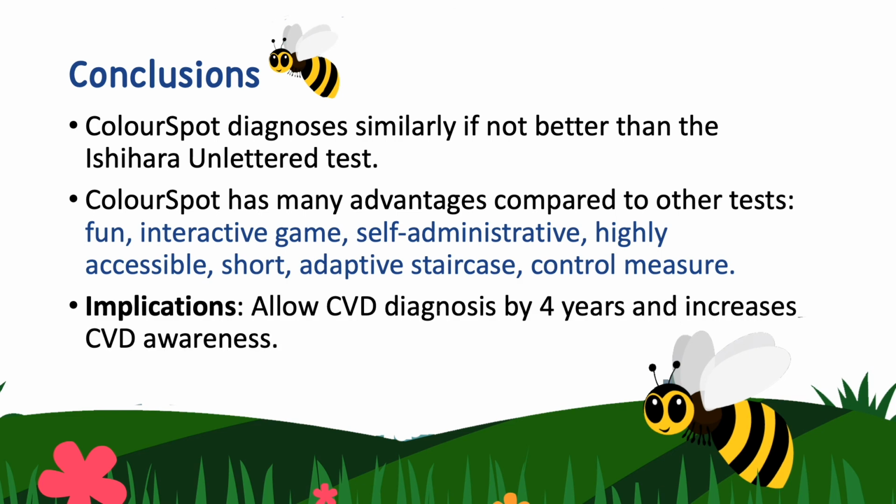ColourSpot has a lot of potential great impact and implications by allowing CVD diagnosis by 4 years of age. It can change the way we choose to colour vision screen children, especially given the current situation with coronavirus, and it can also increase CVD awareness as well.